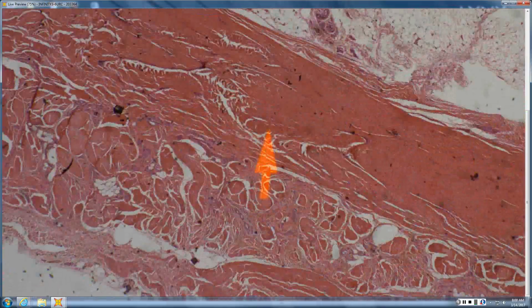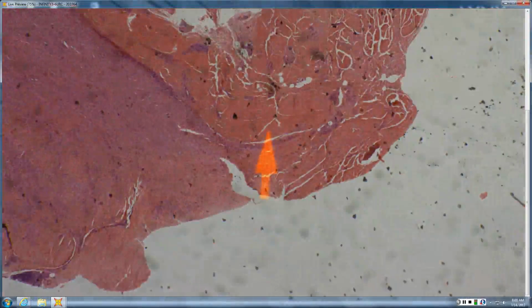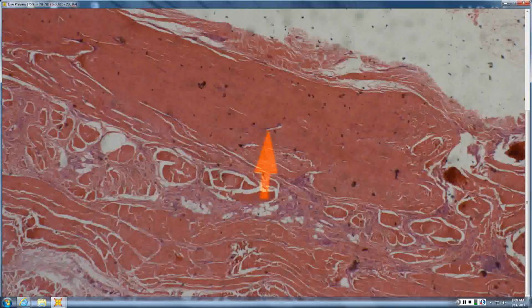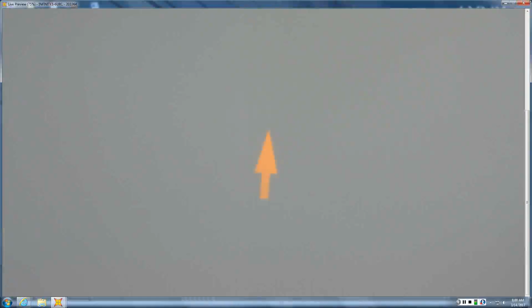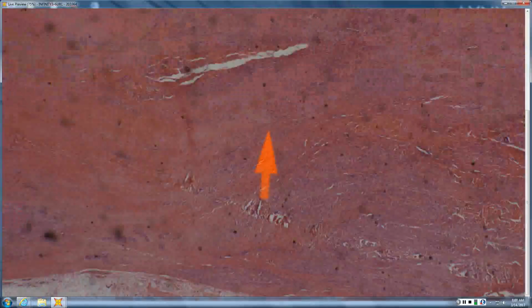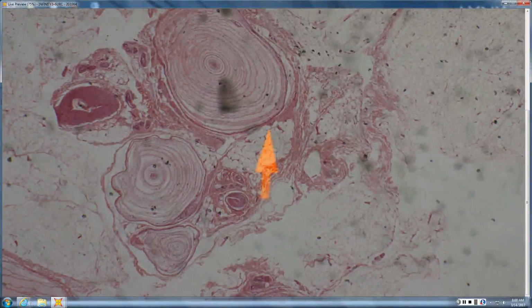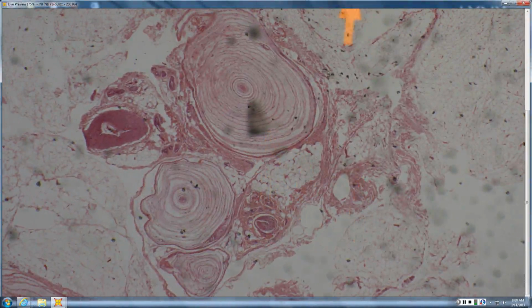Okay. Evenly hypercellular throughout, or hypercellular nodules in a proliferation that's less cellular overall? The latter. So you think this is more likely sarcoma or something benign? Let's say benign. Where do you think you are? Deep tissue, subcutis. And what kind of structure do you have there? That's a big neurovascular bundle. Pacinian corpuscle.